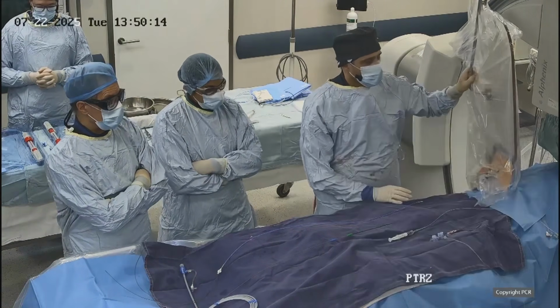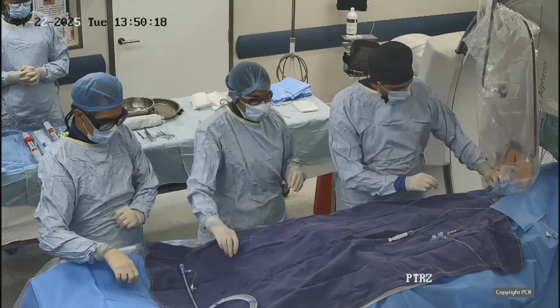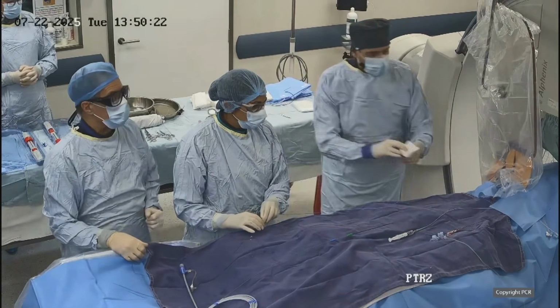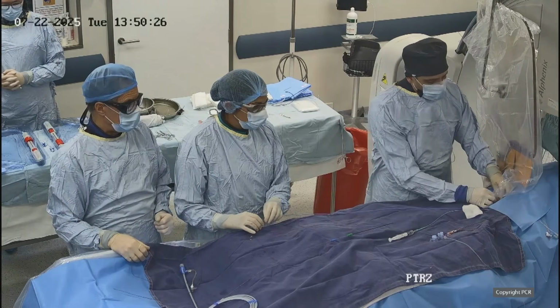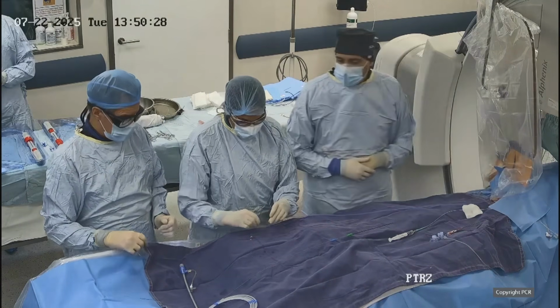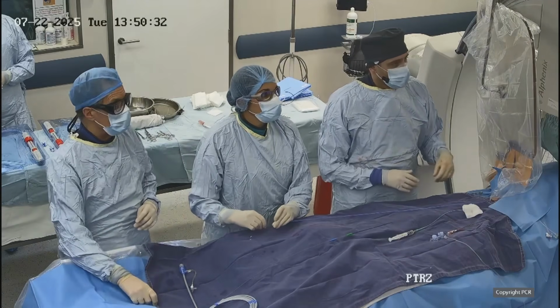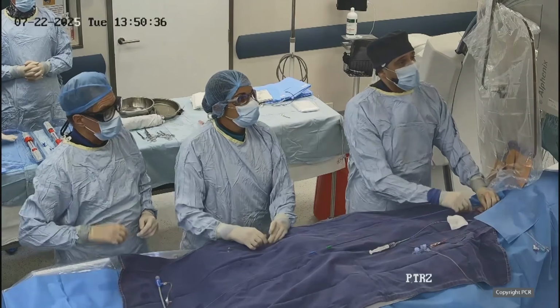So now we are going to put the catheter in the femoral vein, the right one, sorry, to deploy the valve. So we are going to advance first a regular wire, and then we are going to put there a quite stiff wire that we normally use for these cases.